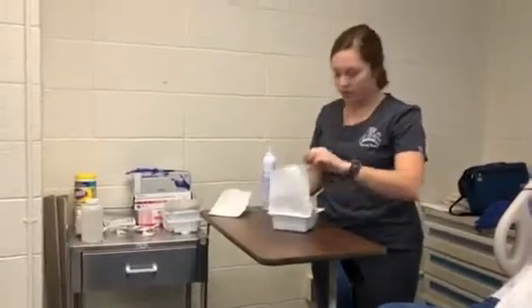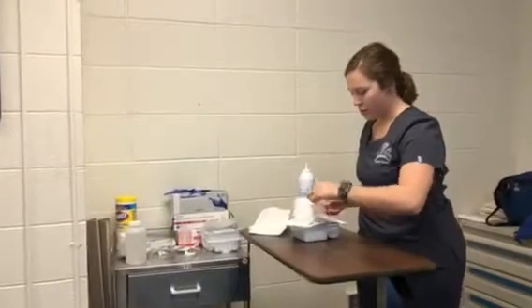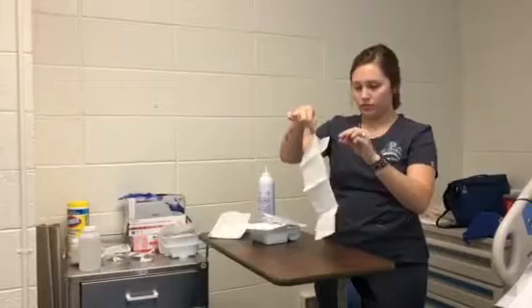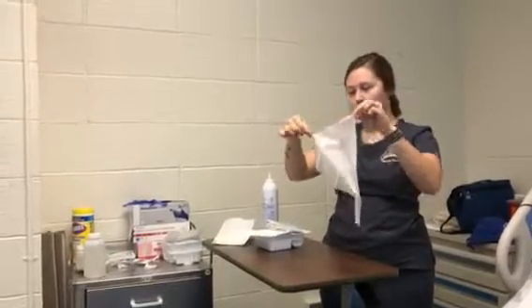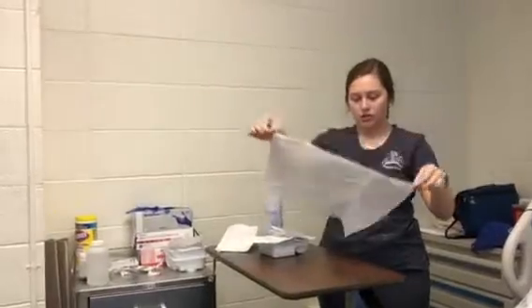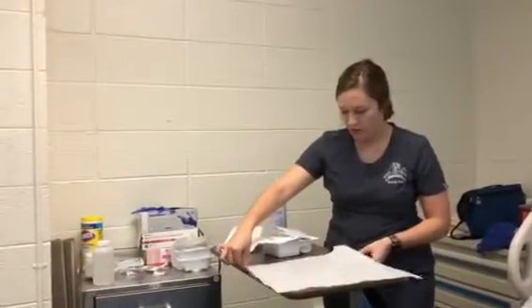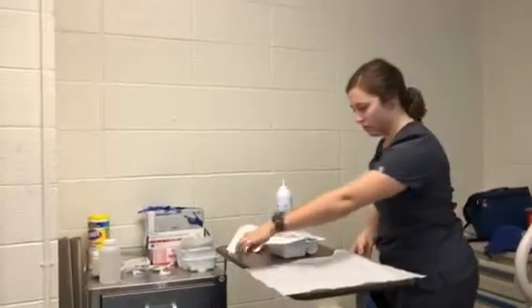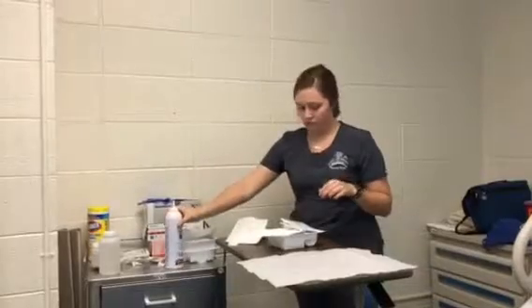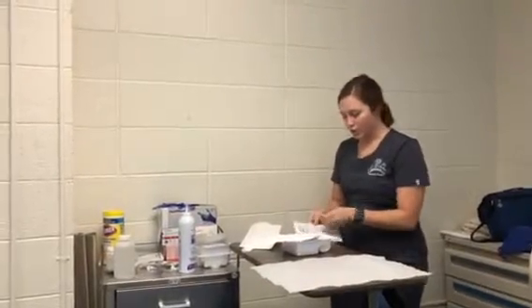Okay, and again, we're going to open this away from us. And then I'm going to take out my sterile drape, and the 1-inch border around it is considered not sterile, and we're going to lay this plastic side down on the table, and this just kind of extends our sterile field. I'm going to get my sterile gloves out and put those on.